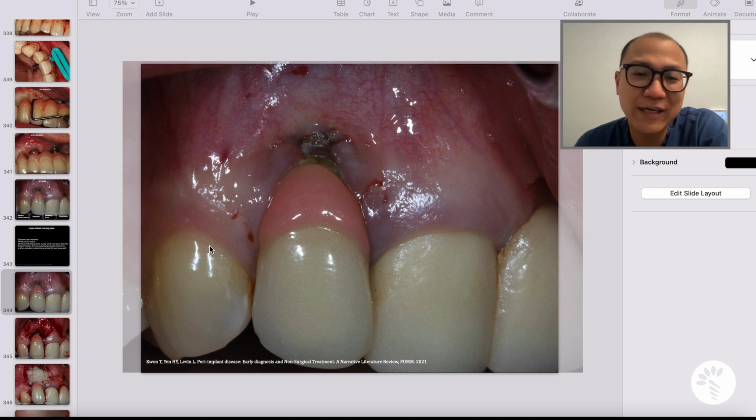And I would like to share a case of Cheryl today with you. Cheryl was referred to my practice several years ago for evaluation of gingival recession, or I should say peri-implant mucosal recession around a maxillary canine. You can clearly see there is mucogingival deformity with no attached tissue, and threads of the implant are exposed clinically. And you can also see plaque around them.